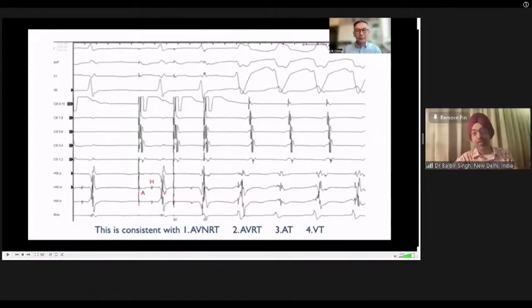So this is RA pacing. You can see this is a pacing beat. It then goes to the CS, then to the His, so it conducts to the His. There is a next one. So this is a rapid pacing. You can see a fixed rate of pacing. I don't know what cycle length it has paced, but you see a rapid pacing.